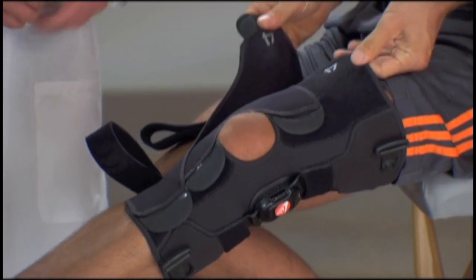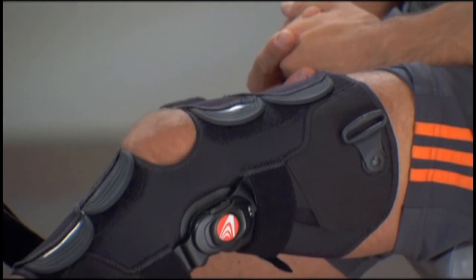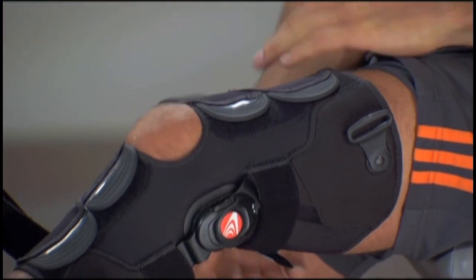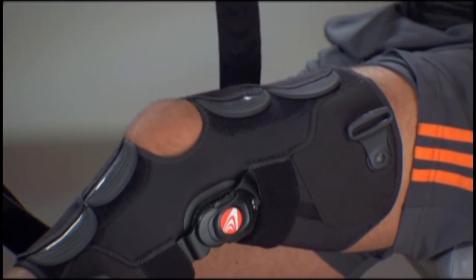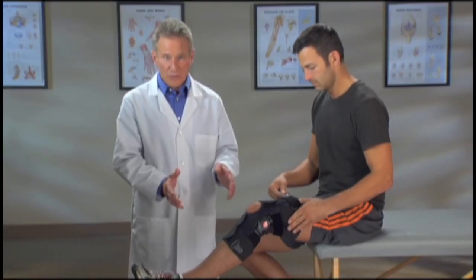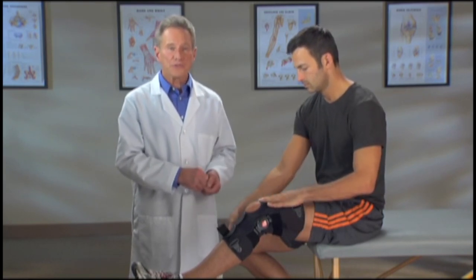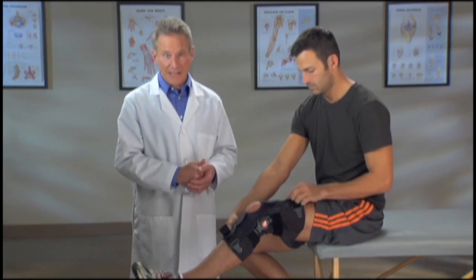Now tab number four, pull it across the upper thigh. Finally, pass strap number five through the ring on the outside of the thigh. To make sure the brace doesn't move, continue to hold the brace with one hand while you pull the strap snugly and attach it back on itself.